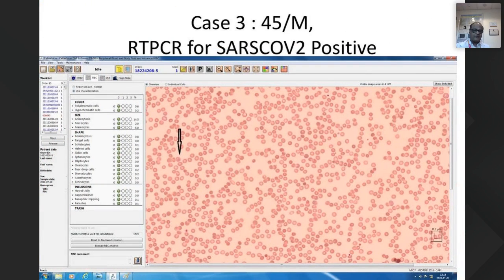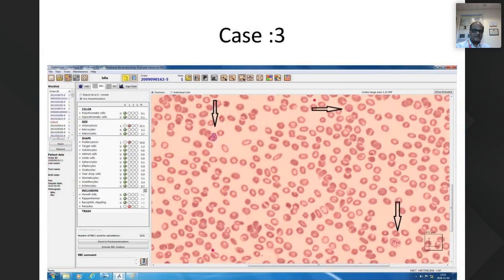It was a 45-year-old male. Again, I told you there was no flag of criteria on your hematology analyzer, but the smear was sent to smear making and Cellavision. Here you can see our technical staff annotated some cells. There's no flag here in the RBCs, but our technical staff made an annotated image. This image came to us on night duty, and they were able to share this with us. And further imaging of the same case, they had put it over here. And you see parasites have been flagged in your Cellavision.